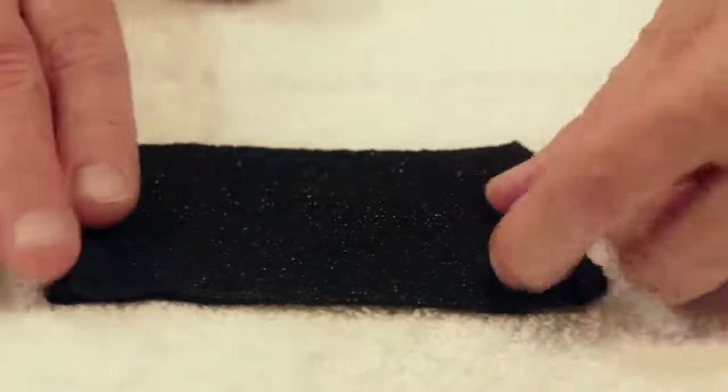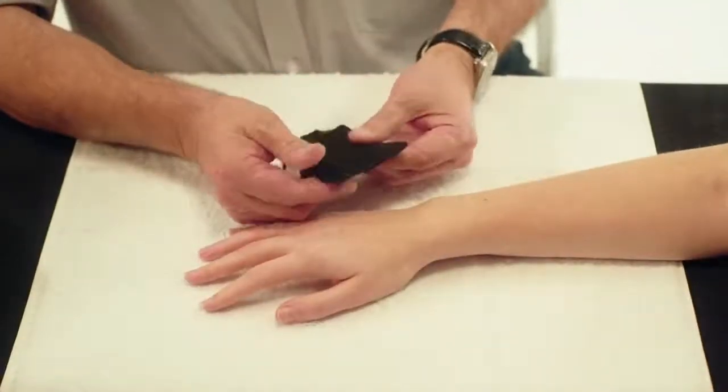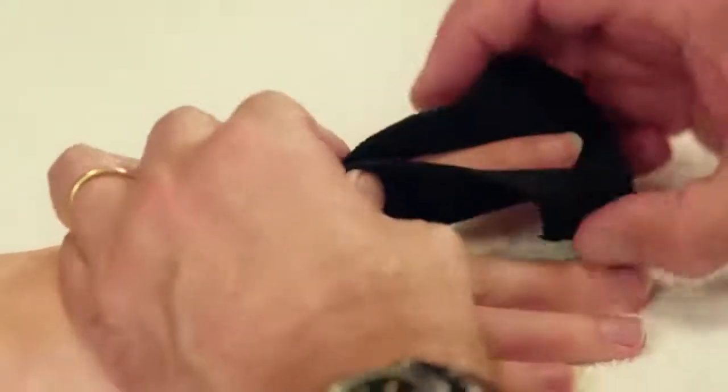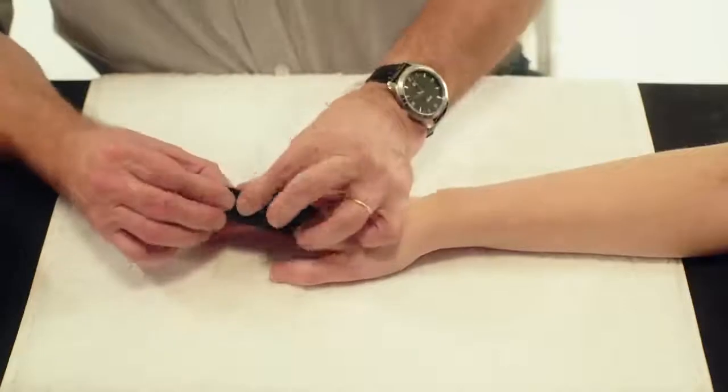Stretch it slightly. Place the Orficast on the palmer side of the finger and pinch it together on the dorsal side.